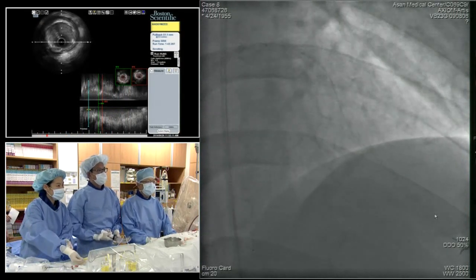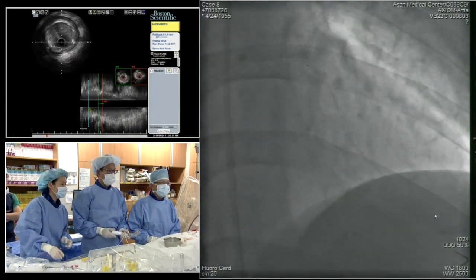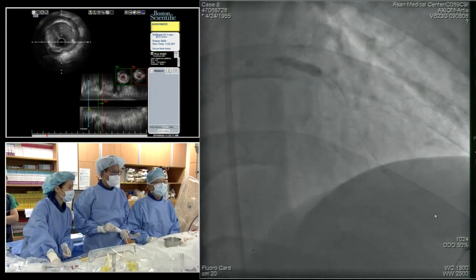It was done in Asia, and Dr. Rabaya presented. Can you go ahead and inflate? It's actually, the result looks quite good. Really, the TLR is like 4% or less, depends on the set. 8, 10, 12, so Alan, 14, we have about a minute left.